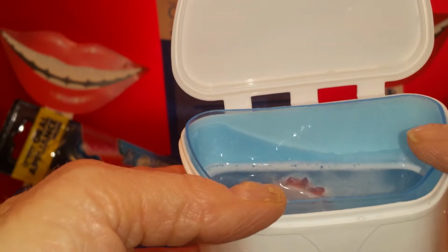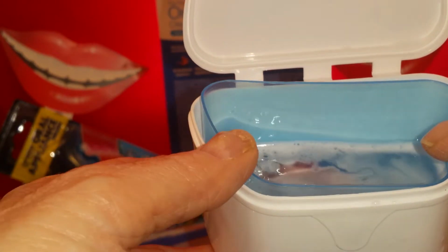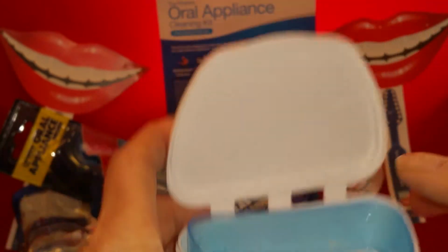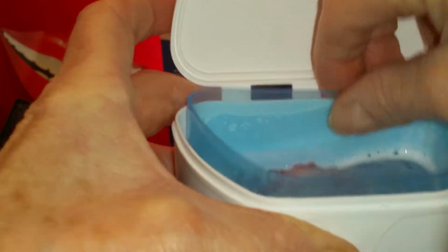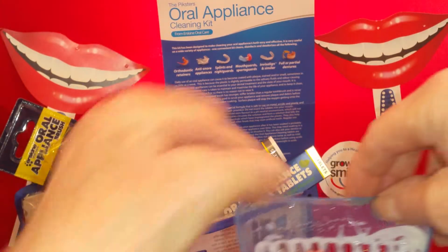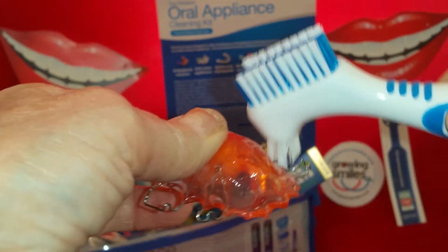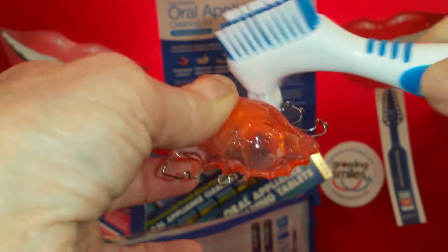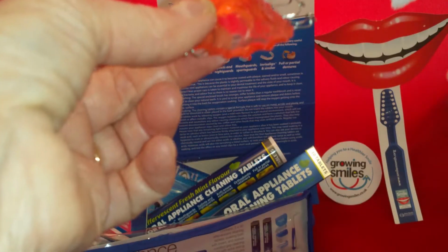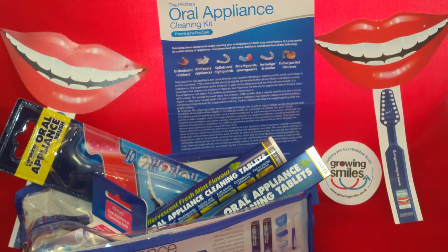It just depends on how you've been advised to use these things, and everyone's use is going to be slightly different, so always get advice from your dental practitioner on that one. Once you're ready to actually wear it again, take it out. Rinse it under cold running water. Scrub it again, just to take off any other debris. There are lots of little cribs that hold the appliance onto the teeth, which are really fiddly, so really get into those. Make sure you clean the bit that's going to go against your mouth. Rinse it under water, and then pop it back in your mouth. So that's a rough idea of what you'll do with that.